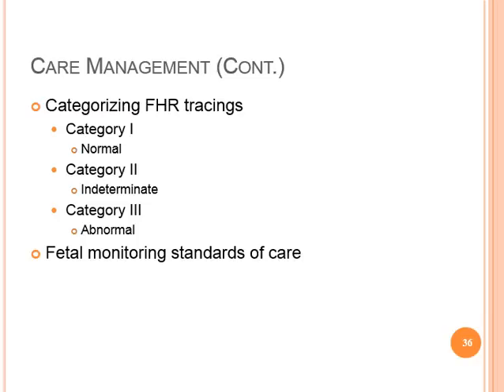In your textbook on page 396, please look over the blue box. It's titled Legal Tip, Fetal Monitoring Standards, and it just gives you a brief look at what the perinatal nurse is responsible for. So the perinatal nurse is responsible for interpreting the fetal monitor tracings. They're responsible for initiating interventions based on the patterns, documenting those interventions and those patterns, and notifying the physician or the midwife in a timely manner.